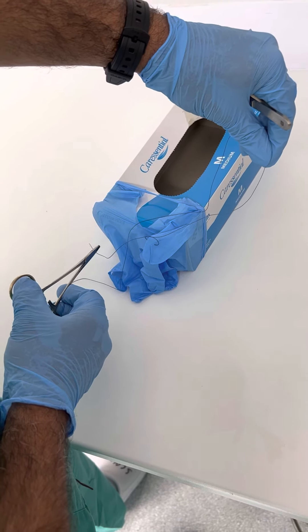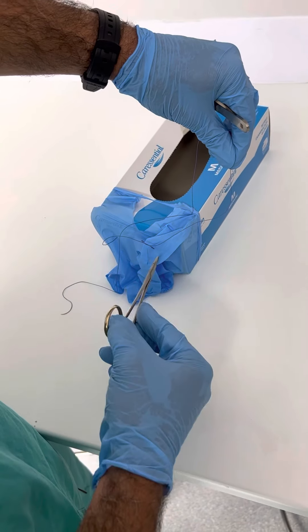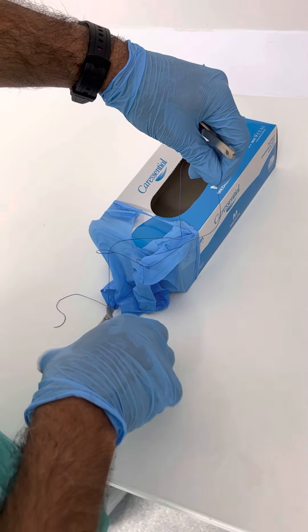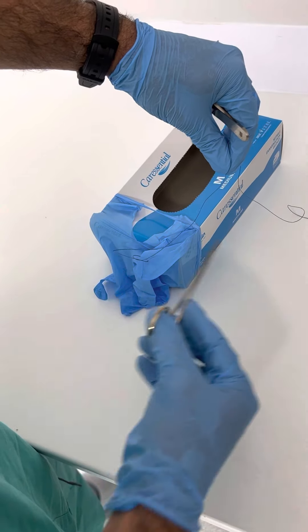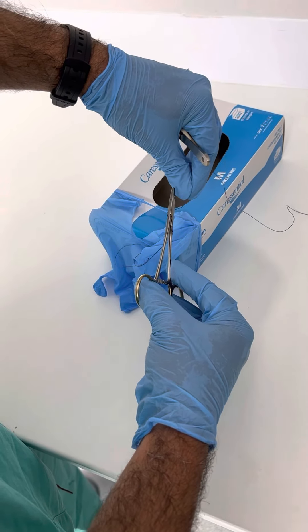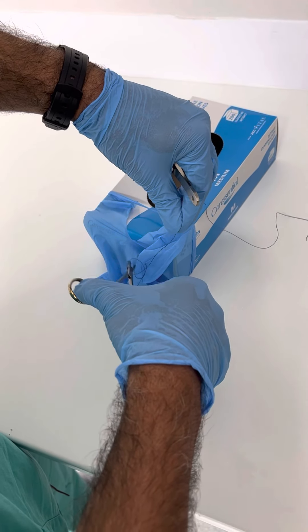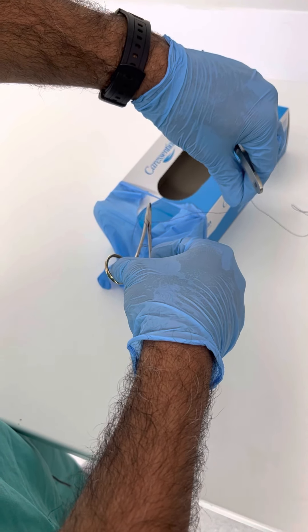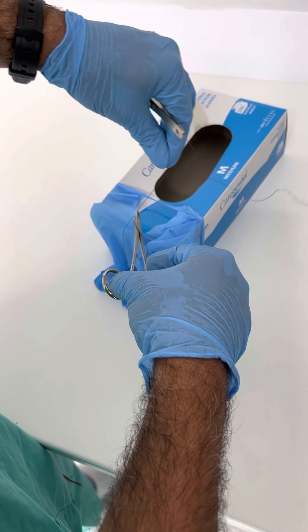My left hand stays there, and again I've now got a new V this time. My left hand stays, and again this stays inside the V. Can you see that V there? Not outside, but inside the V. So again I do my throw there, and I come and grab this. My left hand, which was on the right side, needs to come back to where it was before.